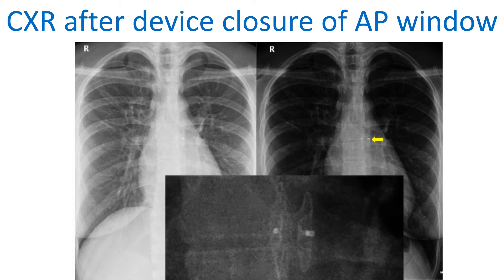The second upper panel shows a darkened image of the X-ray which makes the device a little more prominent. The lower middle panel is a magnified view of the device which clearly shows two discs of the device, with the left disc being smaller than the right one. The shape of the device is suggestive of an Amplatzer device.